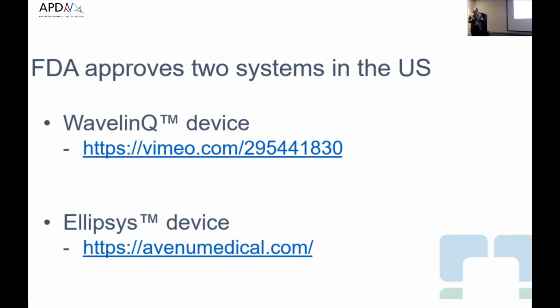Then using a magnet, the catheters are brought together. Then there is a little electrode that comes in place that is activated and generates energy, and the anastomosis is then created. So the entire procedure is done endovascularly. The problem here is, as you can see, there are multiple vessels that open up, and that requires interventions.